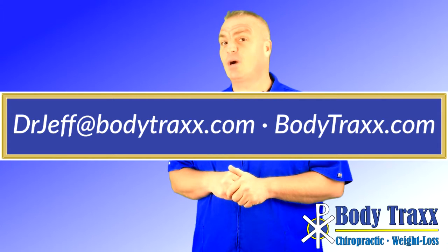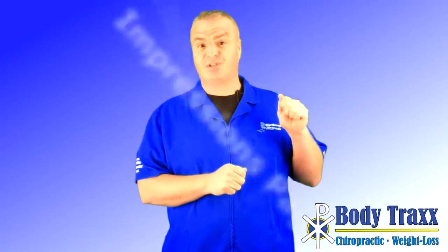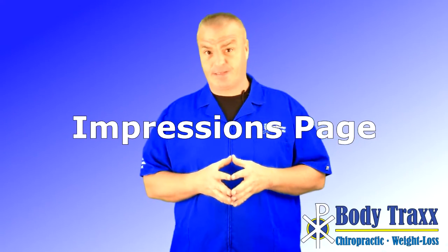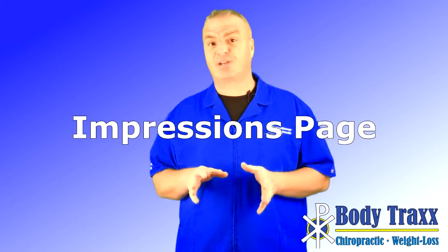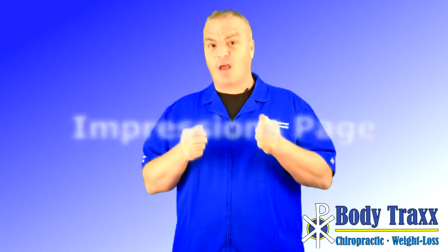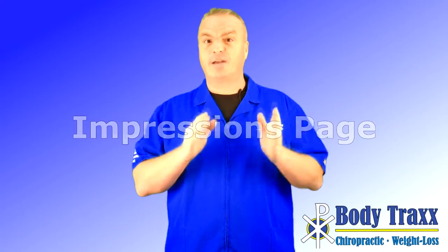All right, now somebody walks into my office and they have an impressions page of an MRI that was done to them previously. So what is this impressions page? The impression page is simply the written notes of the person who read the x-rays. Now these are very talented people and they write these in a way that doctors will be able to read them around the world.